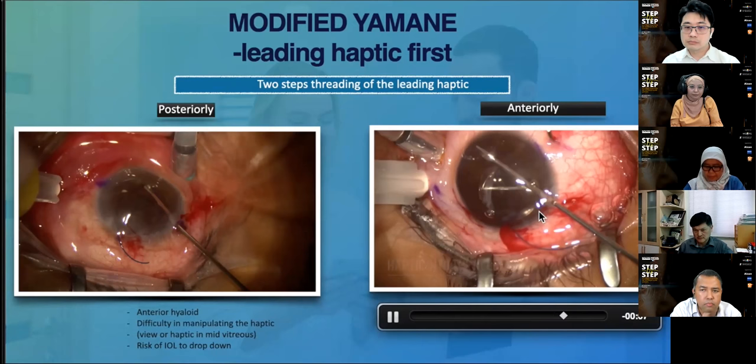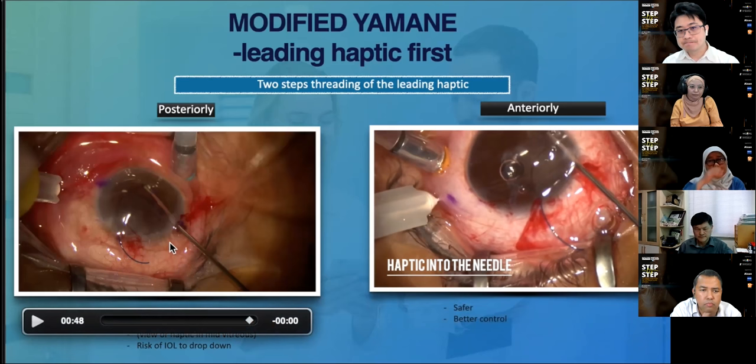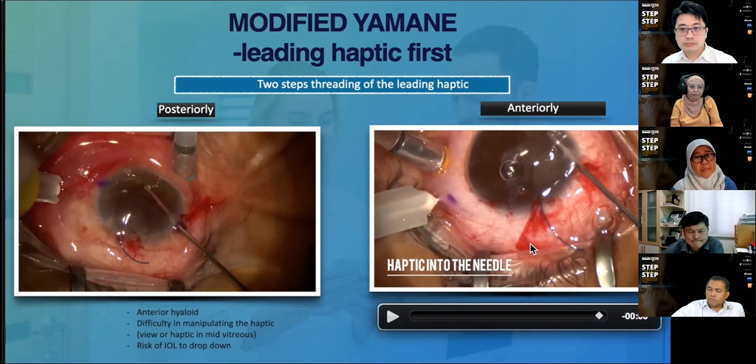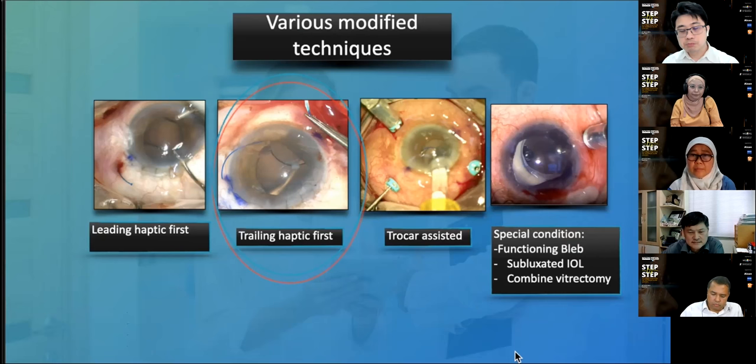Personally, I have a few concerns with the retropupillary injection because, as we know, we will be working within the anterior hyaloid area, so potentially it might cause traction on the retina. Viewing can be quite challenging at times, not only because it is behind the iris, but also because it might be beyond the focal point of the microscope. And lastly, we might drop it down if we are not careful enough to hold the trailing haptic. So I do feel that placing the lens in front of the iris is a safer technique to do. Now, let's look at other techniques.